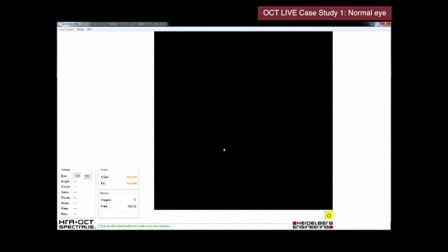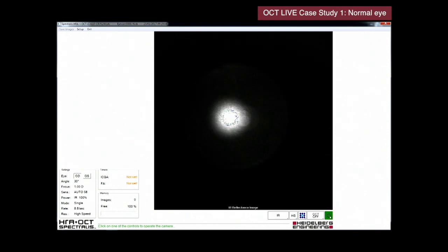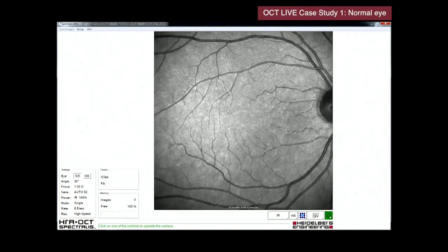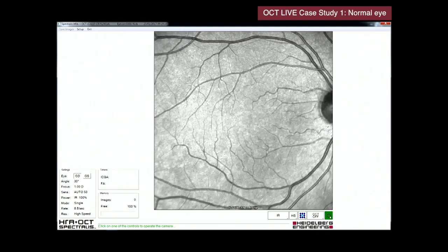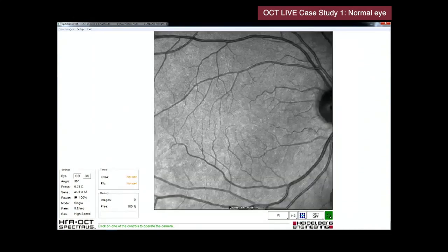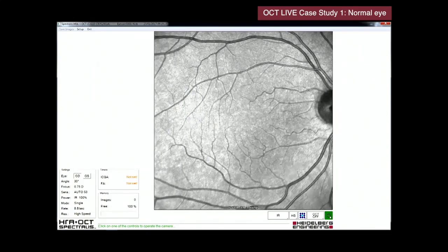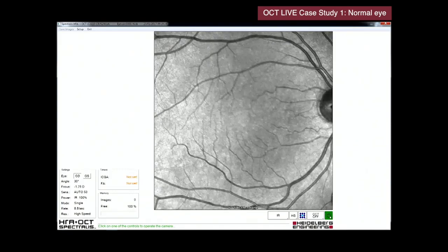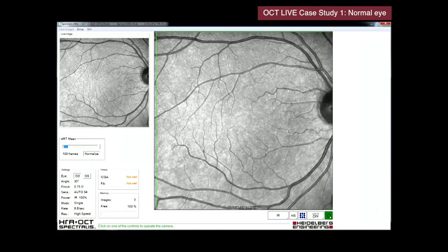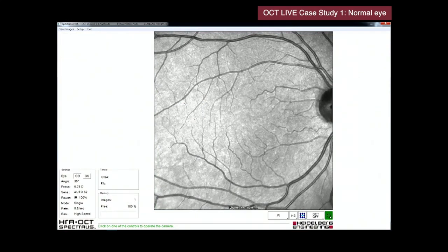So during any OCT assessment, it's really worthwhile just to start out by assessing the fundus. Now, with a scanning laser ophthalmoscope, which is what we're using here, we're able to scan the eye using different wavelengths of light. We're using infrared light, near-infrared light. This means it's invisible to the patient, so patient compliance is extremely high, and we get a very high-resolution image. We can visualize the small microvascular structure. We'll see pigmentary change. Fluid is very easily detected.